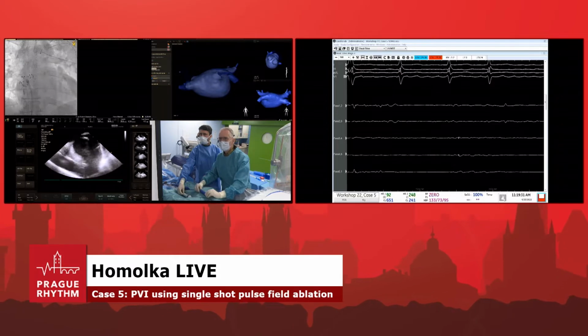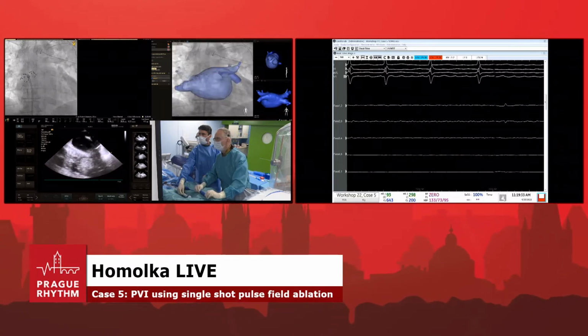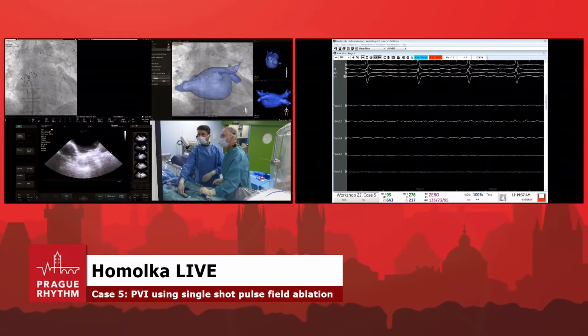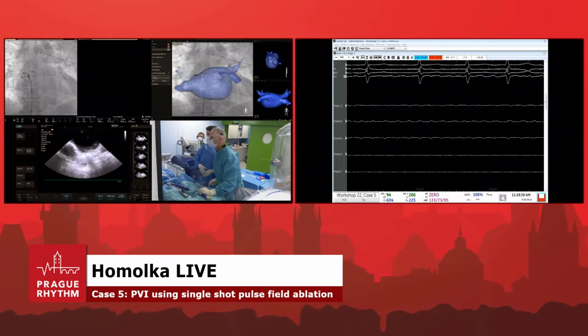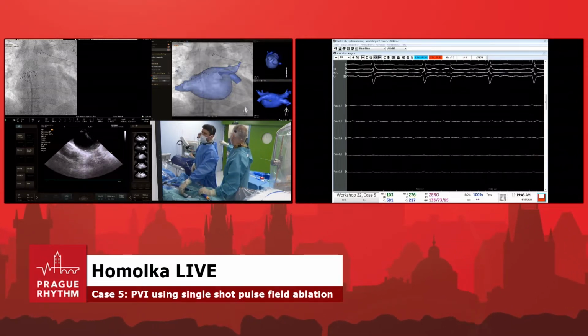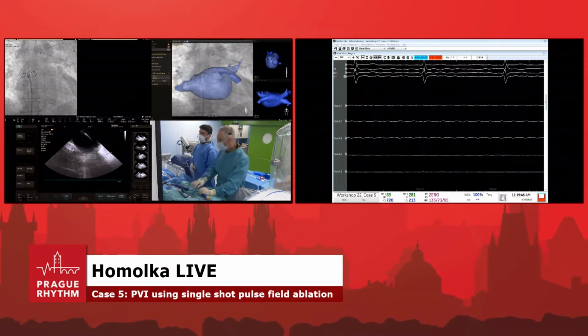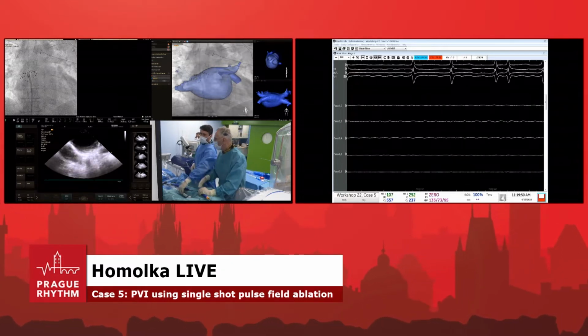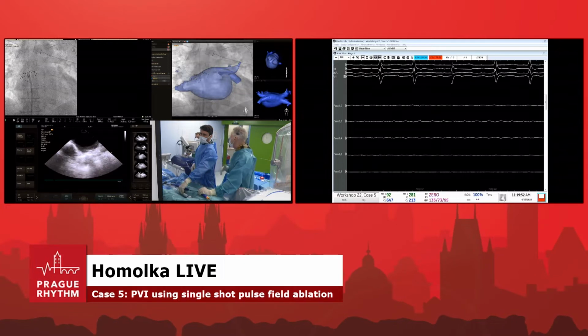Okay. So I'll start from the right side. And you can see on the integrated, okay, I will make it live. So we can use the CT for posterior wall ablation. So let's go for flower on the posterior wall. Actually we have 2 applications for flower on the posterior wall each. Okay, let's go.